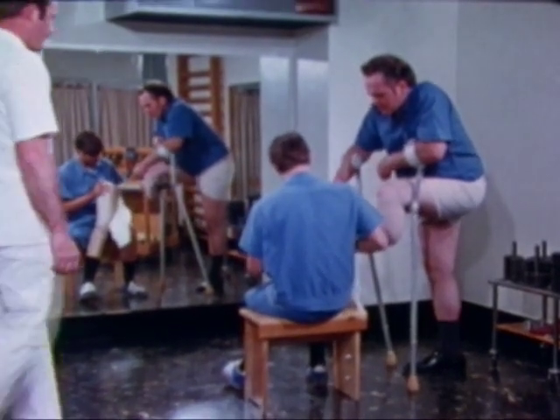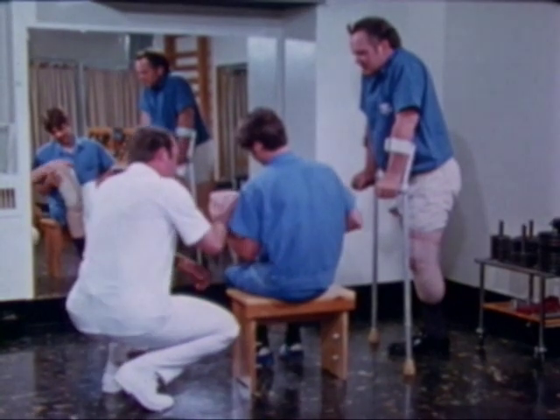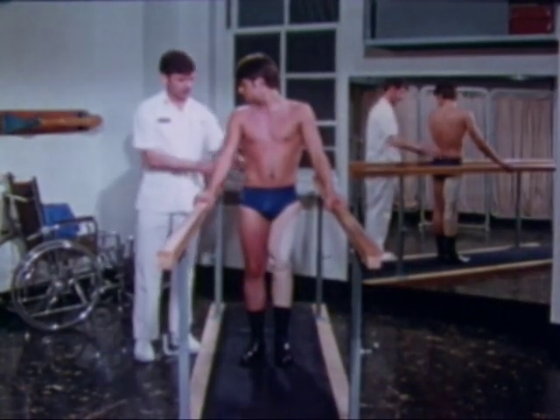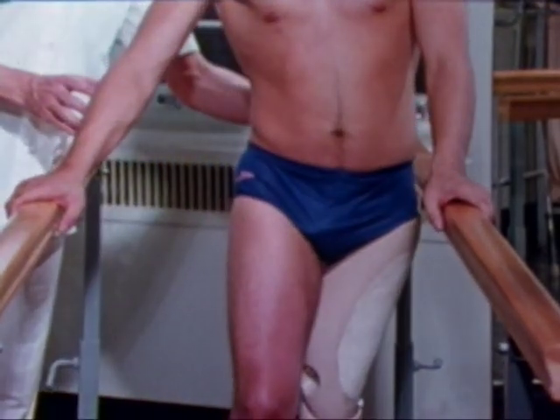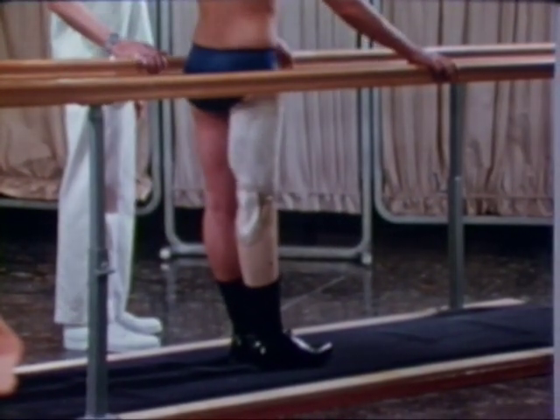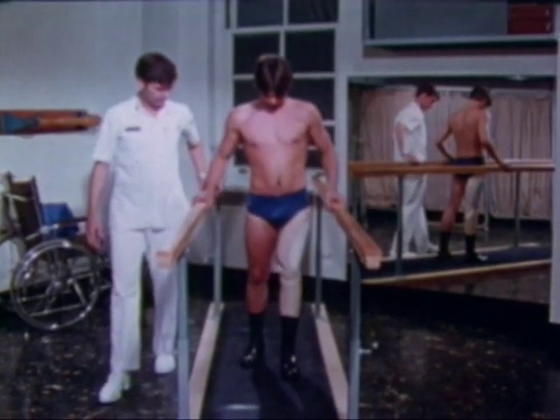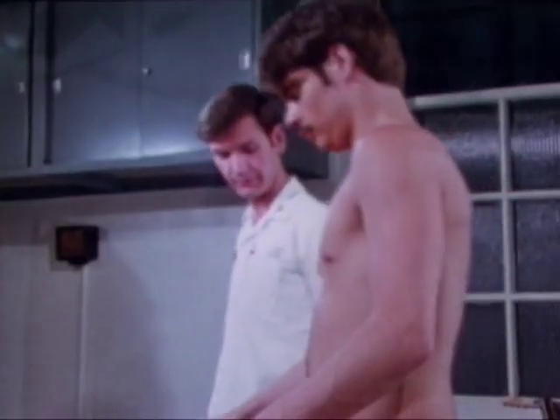Throughout this stage, and until the patient has become ambulatory with the prosthesis, he should continue using the bed positions described earlier to avoid the inadvertent development of joint contractures. Training with the prosthesis begins with balancing drills, which build the patient's confidence and skill. One early drill involves shifting the weight laterally, and another involves shifting his weight backward and forward. A third balancing drill uses a stepping motion, shifting the weight both forward and laterally onto the prosthetic leg. It's essential that you work closely with him on these drills.